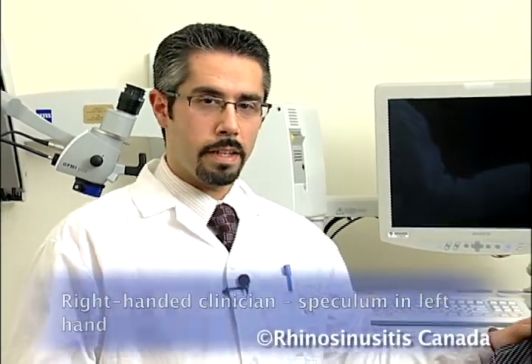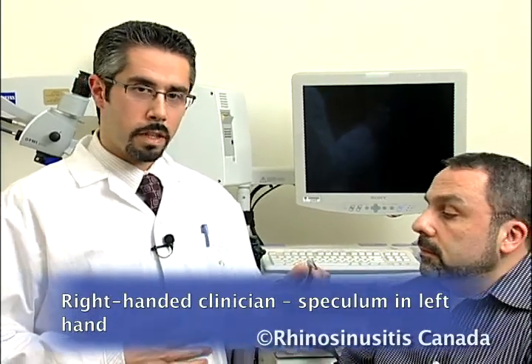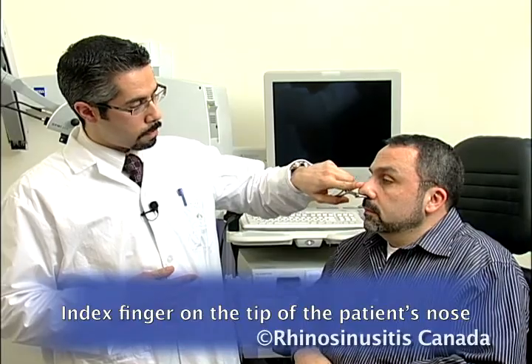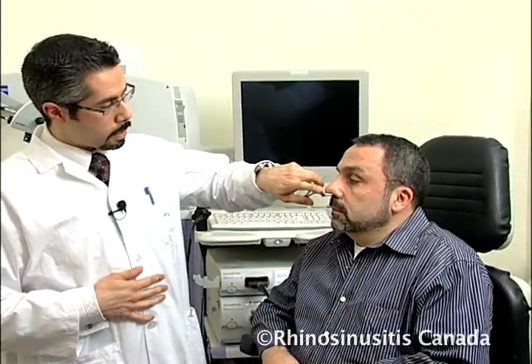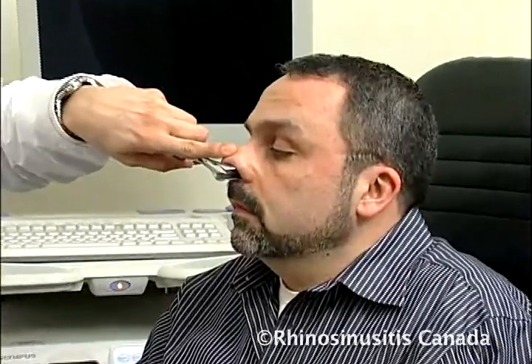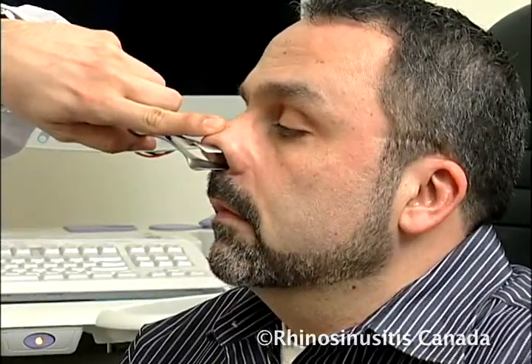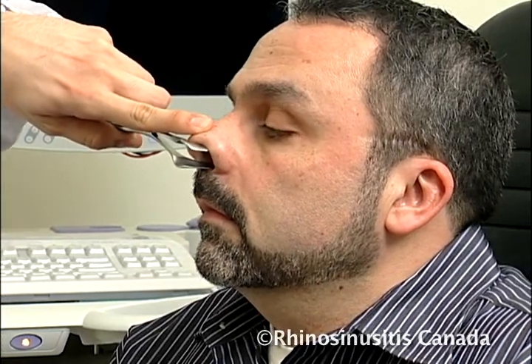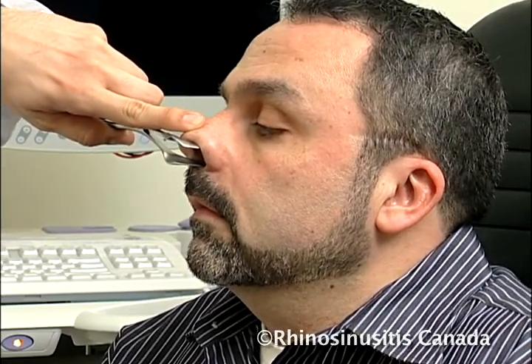If you are right-handed, you should hold the nasal speculum in your left hand and place your index finger on the tip of the patient's nose. The speculum is then passed in the nasal vestibule and opened to gently retract the alar margin. The light of the headlight may then be placed into the nose to examine the nasal cavity.